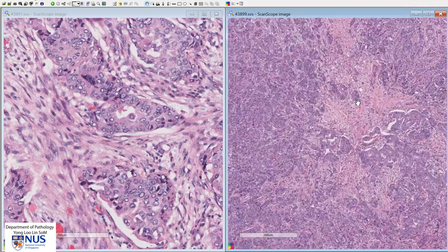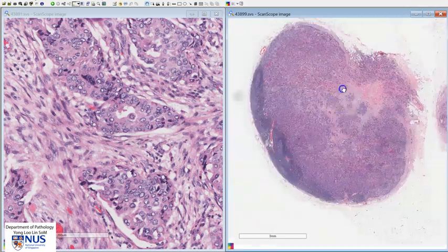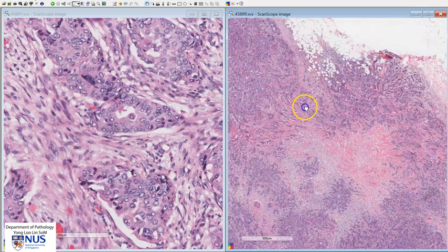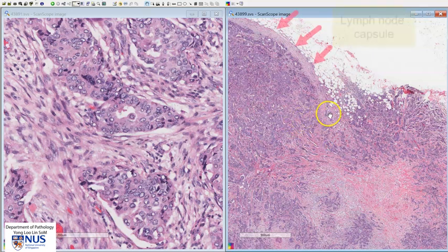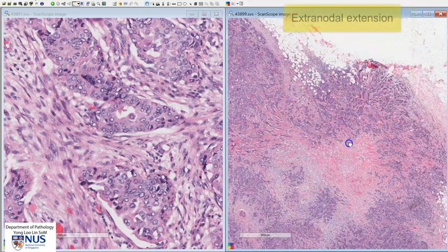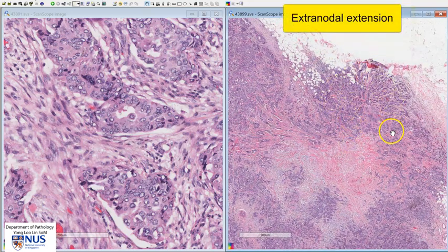In this particular lymph node, there is another feature that is demonstrated. We can see that the tumor has actually extended beyond the capsule of the lymph node into the extra nodal adipose tissue. This is known as extra nodal extension.